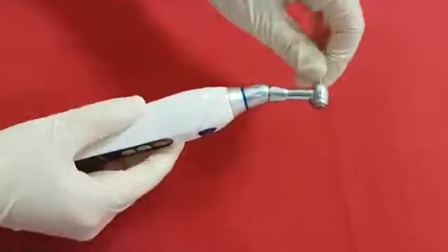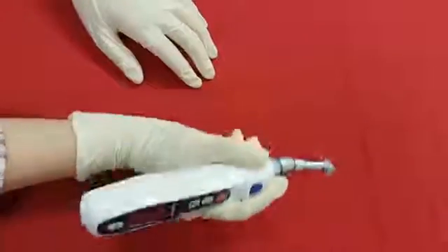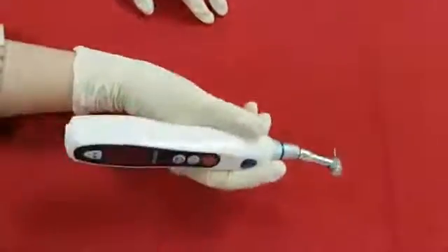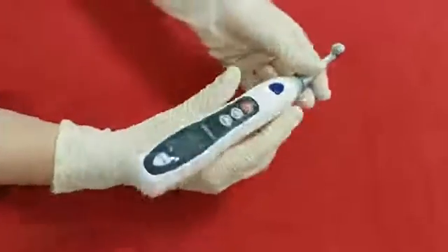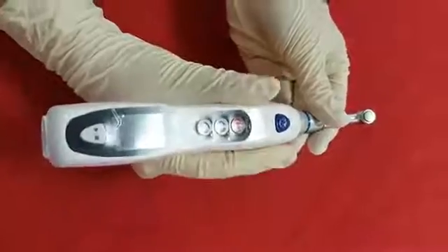When you use the E-Driver, please move the E-Driver body up and down or right and left only, and please do not bend or curve it. It's easy to grip since the body of E-Driver is not too thick or thin.